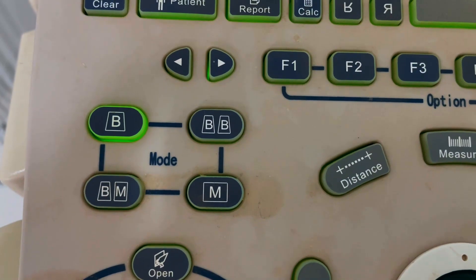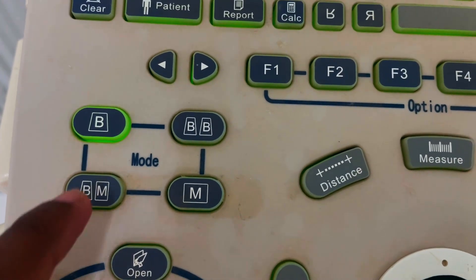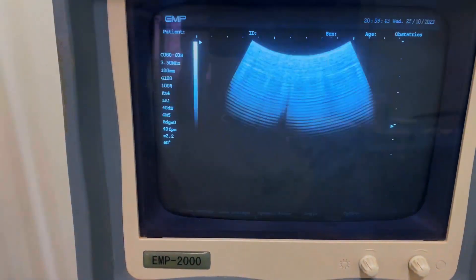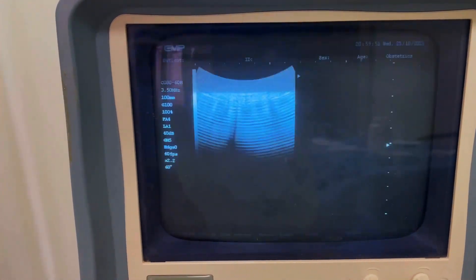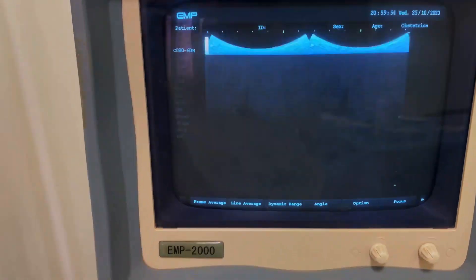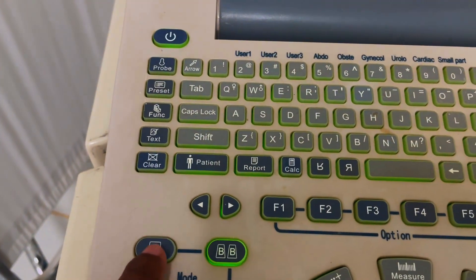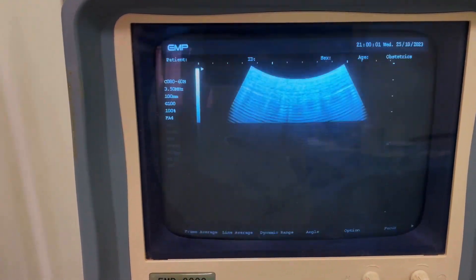Here are the different types of view modes. If you press B, your screen will show one view mode. If you press BB mode, your screen will show two views — dual view mode. If you press B mode again, it will go back into single view mode.